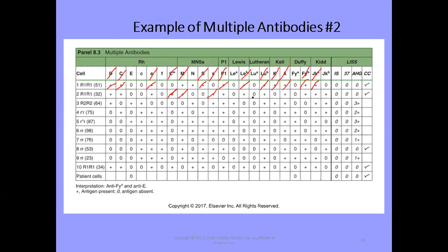Nothing here, nothing here, nothing here. We're going to skip the Kid and wait to see if we can have homozygous JKB to eliminate. The next 1, 2, 3, 4, 5 cells we cannot eliminate.